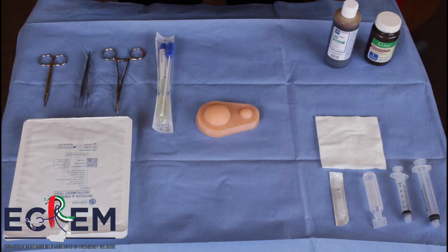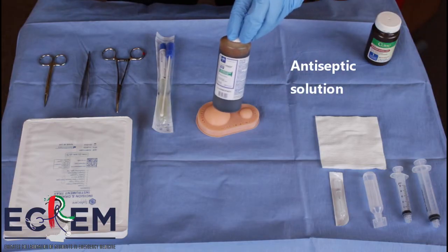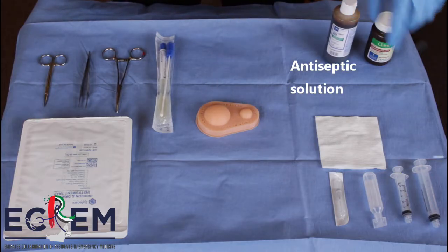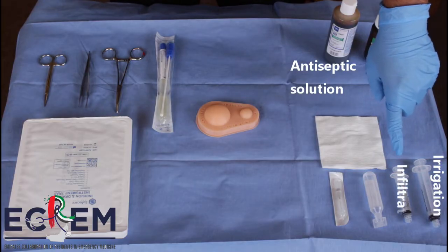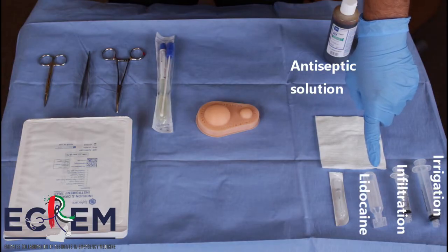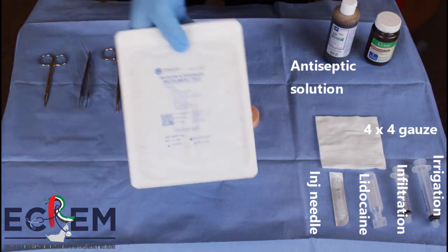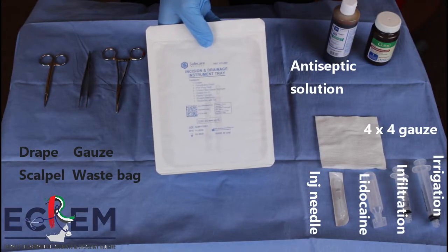Here are our equipment required for the procedure. Firstly, we have an antiseptic solution called povidone iodine, or we can even use chlorhexidine to clean the area. Next, we have a 10 ml syringe for irrigation, 5 ml syringe for local anesthetic, and the local anesthetic which we use is lidocaine. And this is the injecting needle and this is the gauze. Next, we have an incision and drainage tray which contains drape, gauze, scalpel and waste bag with tie.